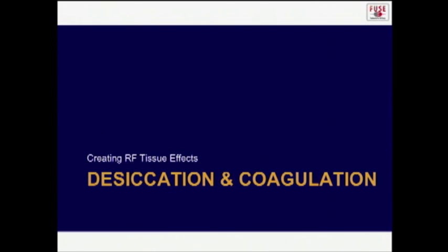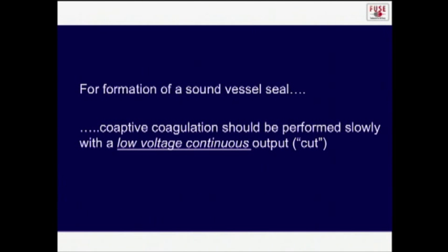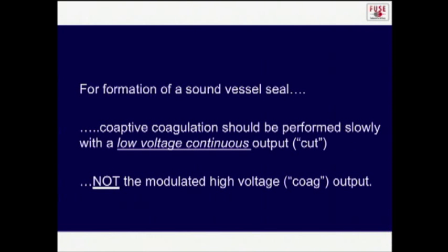Let's move forward here. So desiccation and coagulation. For formation of a sound vessel seal, coaptive coagulation should be performed slowly and only with low voltage output. Only with low voltage output, not the modulated high voltage coag output. This should be a take-home.